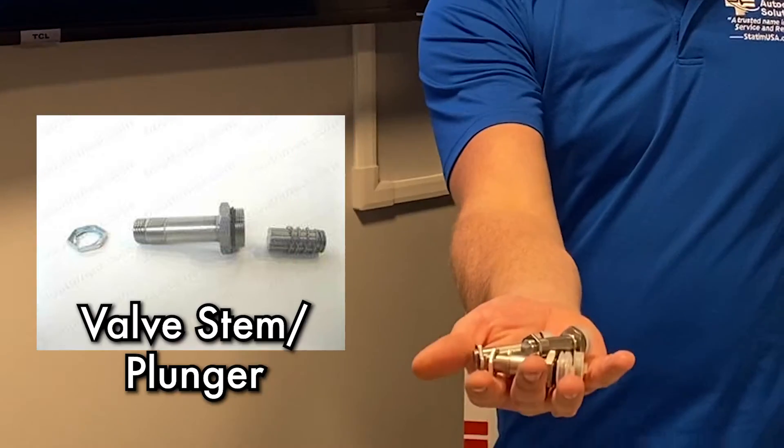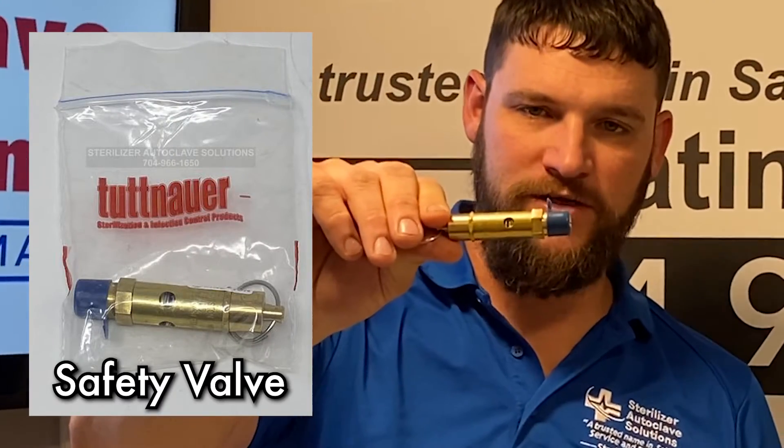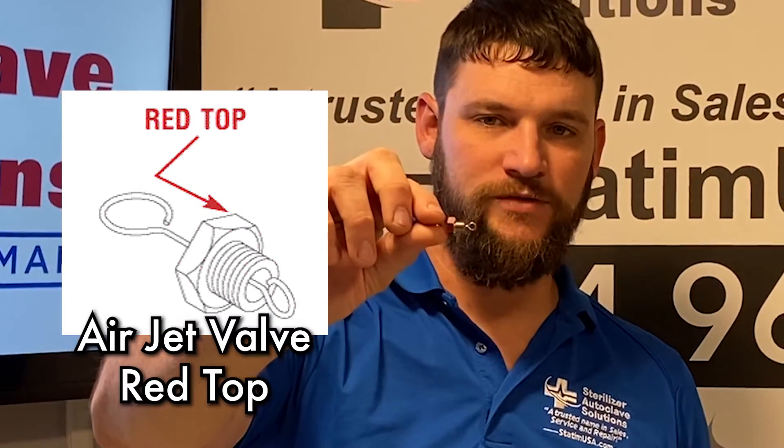Plungers and stems, as well as a safety release valve which is located inside the reservoir, and the air jet valve which is also inside the reservoir.